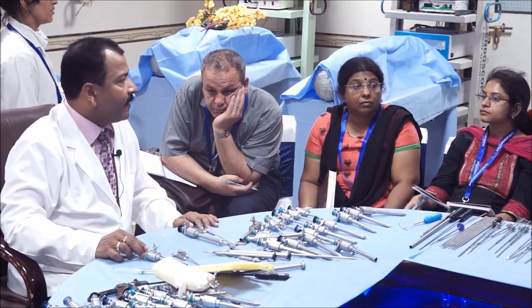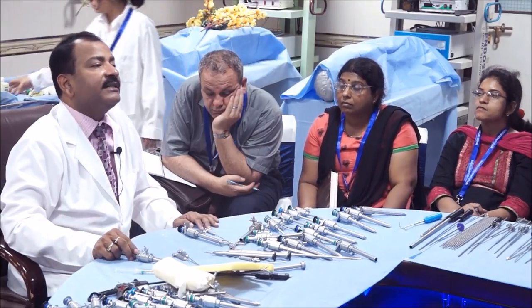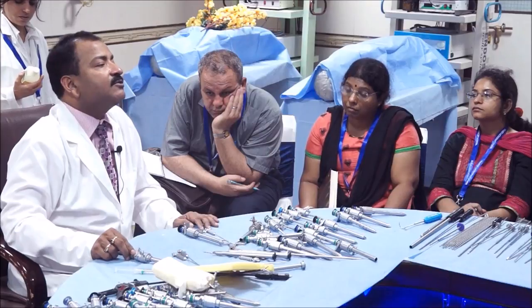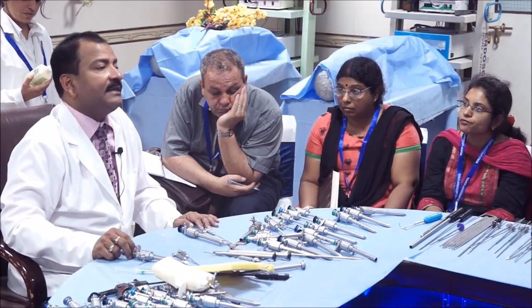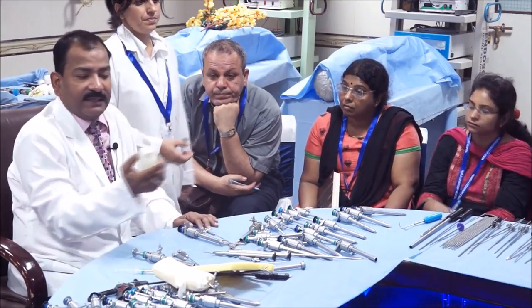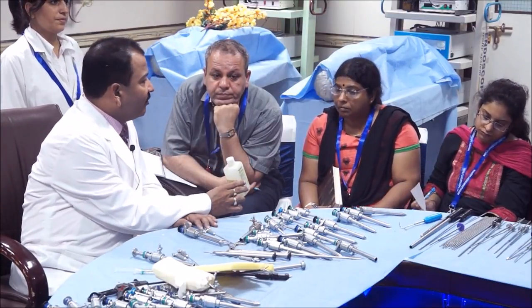Now, the next instrument I am going to discuss. Doctor, you have said that with this material you disinfected the instrument, not sterilized. In the bottle itself it is written high level disinfectant. It is not a sterilization. The word sterilization means each and every microorganism is killed. The word sterilized that we use is a misnomer. All these are disinfectants. If you see on the bottle itself, it is written high level disinfectant. It is written there, the companies themselves know. Do you know why?